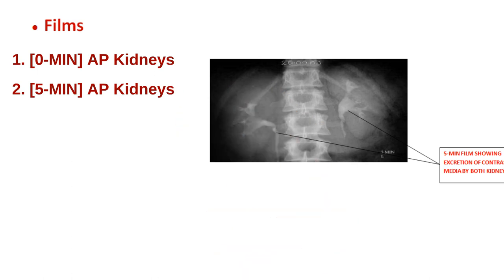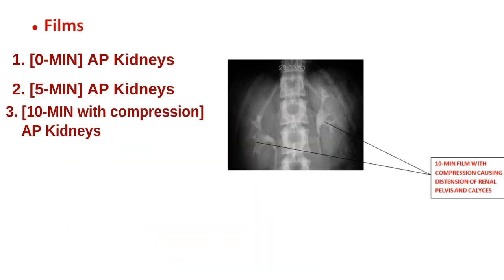The next image is taken 5 minutes after contrast media was injected — also an AP view of the kidneys — and shows contrast media being excreted from both kidneys. In departments that use compression, the compression band is applied after this view. The purpose of compression is to distend the renal pelvis and calyces, making them much more visible, though it is very inconvenient and many radiology departments do not use it today. The next image is taken 10 minutes after contrast media was injected, also an AP of the kidneys, where compression makes the renal pelvis and calyces more visible.